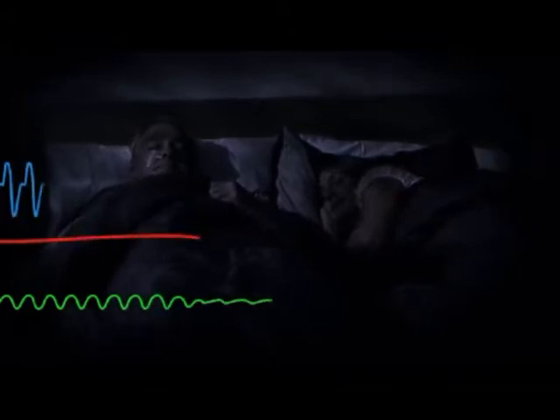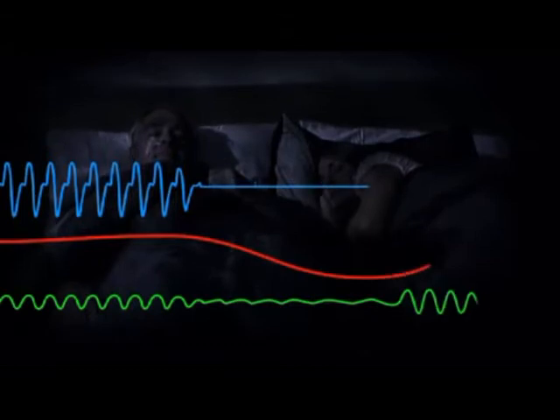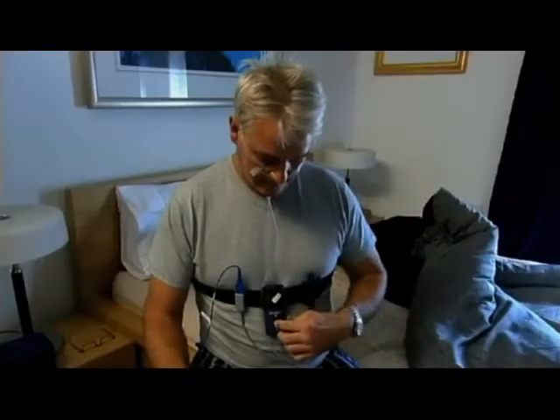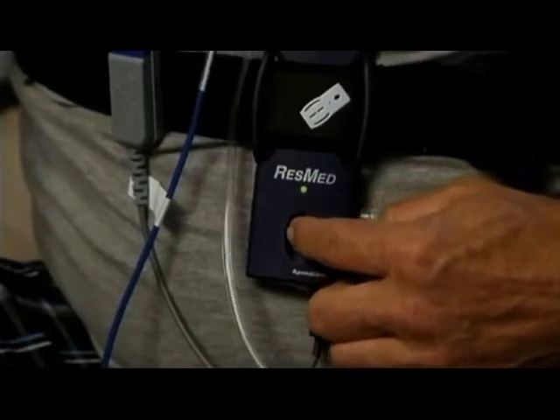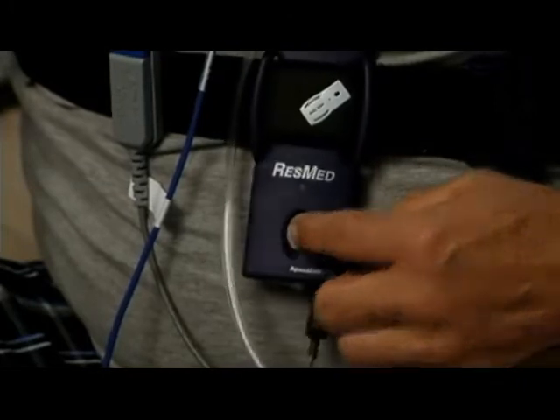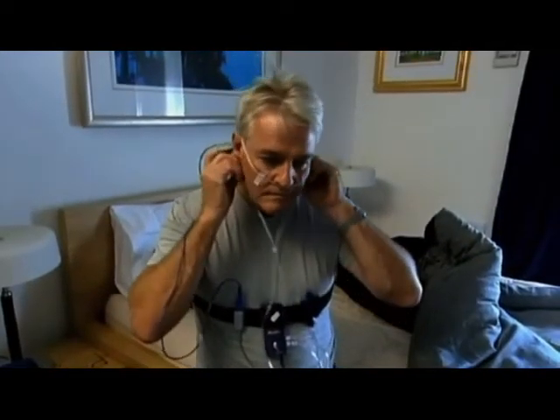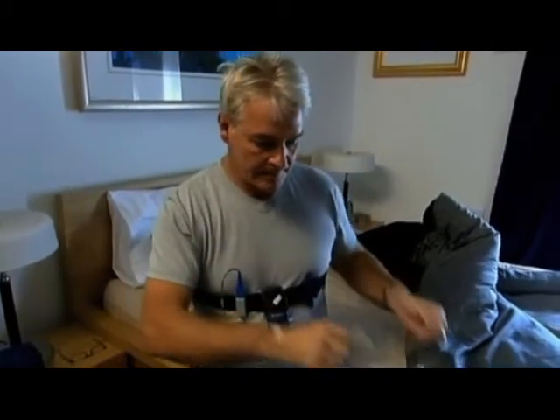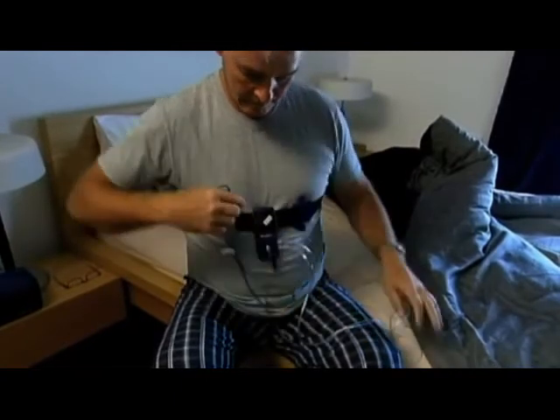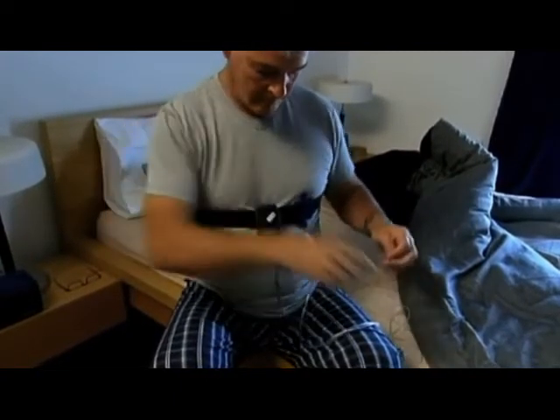You can then sleep normally while the ApneaLink Plus monitors your sleep, checking breathing patterns, how much oxygen is in your blood, and recording possible apneas or other breathing abnormalities. When you wake in the morning, turn the recorder off by pressing the button until the green light goes off — this should take one to two seconds. Then remove the tube from your nose and the tape and sensor from your finger. Save all the components and return the ApneaLink Plus system to your clinician for analysis.